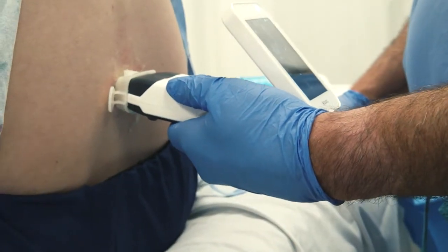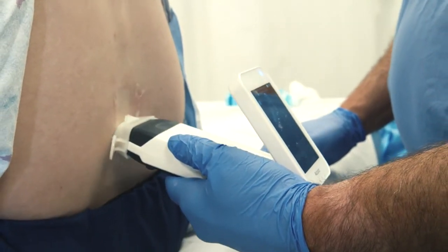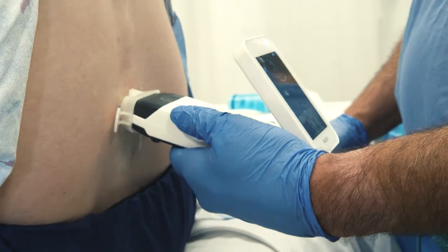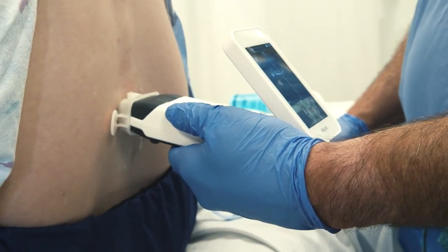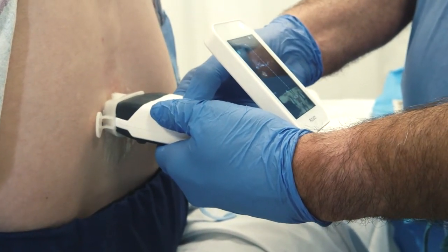SpineNav 3D identifies anatomy in the transverse orientation only. For other orientations, turn off SpineNav 3D overlays or scan using the bone icon from the home screen. If the scanning angle is too steep, then only spinous processes will be detected. For proper identification of the interlaminar space, arrange the scanning plane angle to be perpendicular to the spinal anatomy.